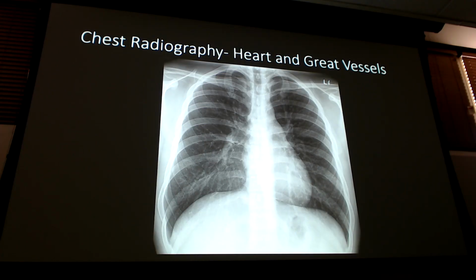Exposure. Let's talk about exposure. I can see my lung markings throughout on the bottom two-thirds. I can make out each of the thoracic vertebrae going up. My exposure is good. As you get better at this, you'll run through those five: the exposure, the inspiration, the magnification, the rotation, and, say again?